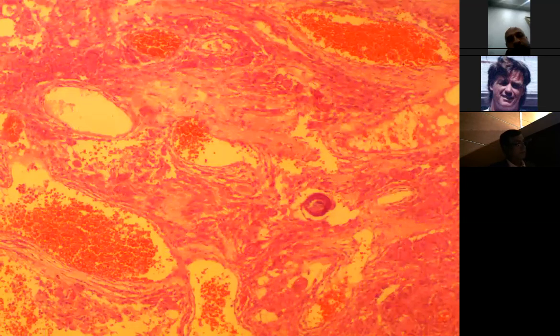In other photos we'll see more vascularity. Here we see multiple vessels in the tumor. Again, another psammoma body. These are the foamy macrophages, an early psammoma body, the swirling pattern of the tumor cells, accumulation of necrotic cells in the center, and accumulation of calcium debris. Again, I will stress the rich vascularity inside the tumor, another psammoma body and swirling pattern, and this is the early one again.